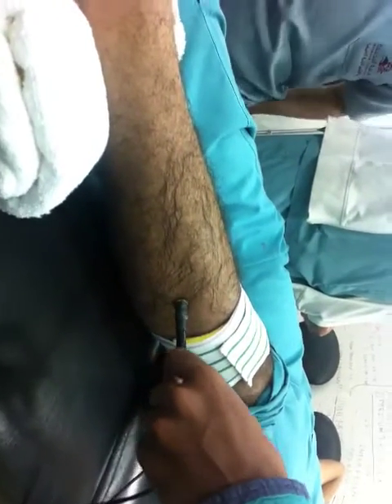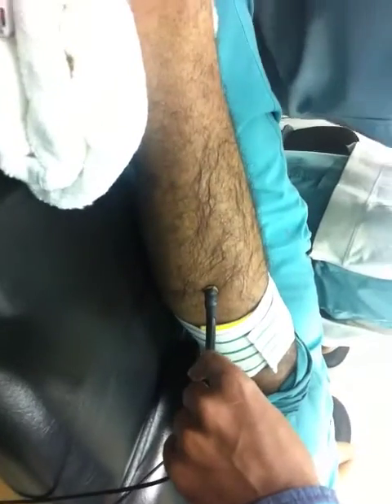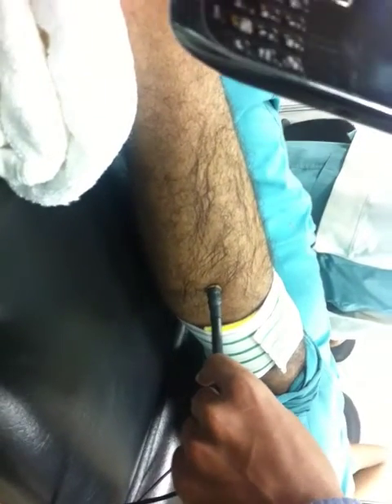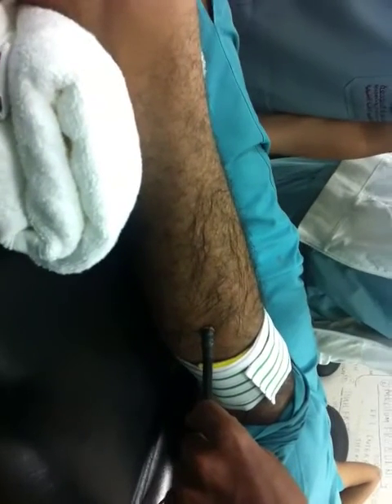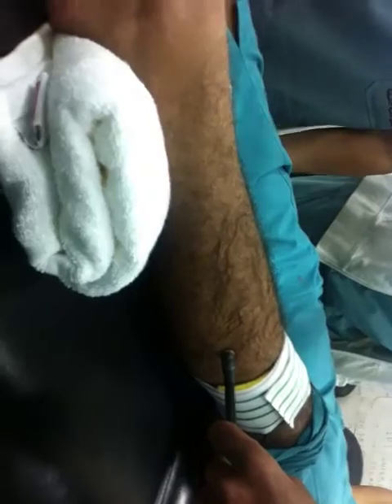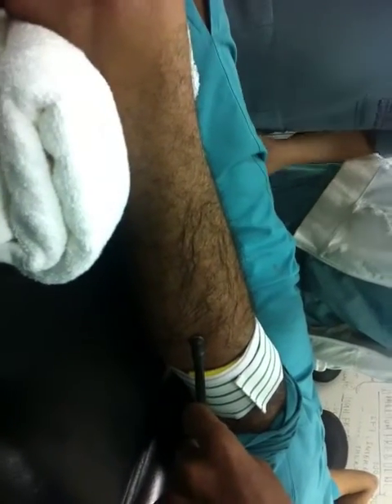You are getting the muscle stimulation — you can see the contraction of the muscle. Getting the current? Yes. But last class we had the contraction and movement in a very nice way.